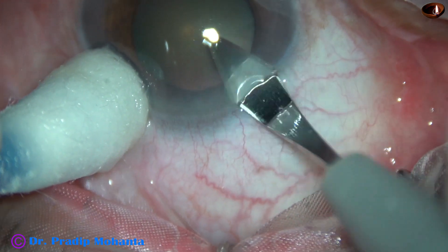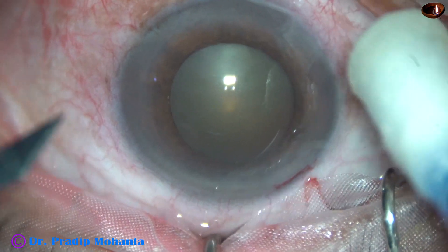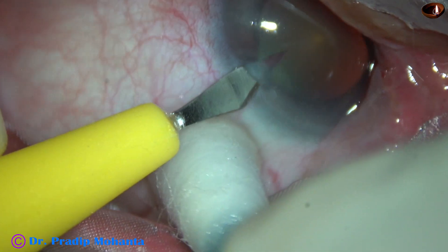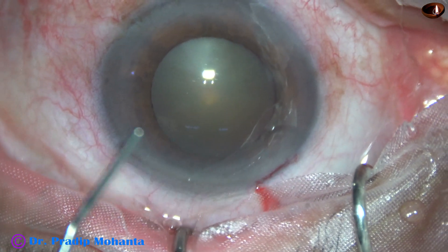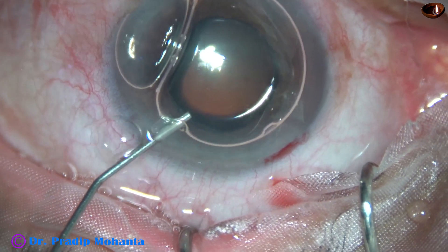This is the main incision with a 2.8 mm steel keratome on the posterior aspect of the limbus. This is a side port on the left side of the main incision, about 2 clock hours away. And now an air bubble is being injected into the anterior chamber.